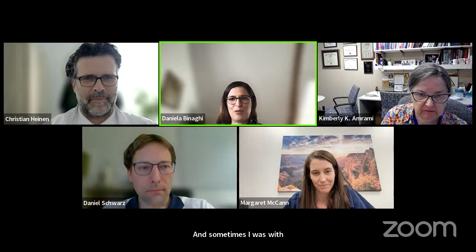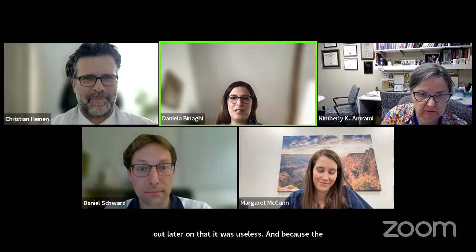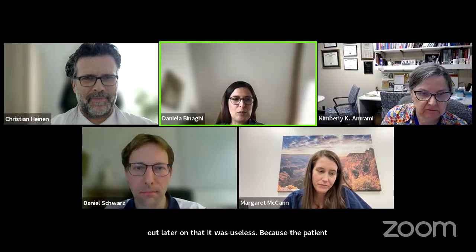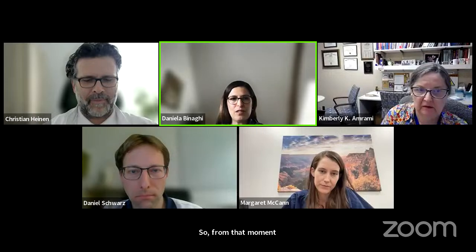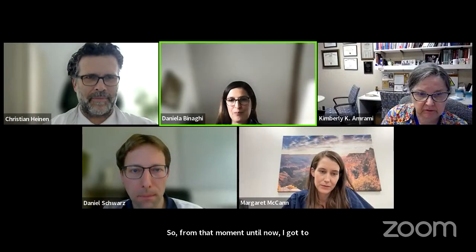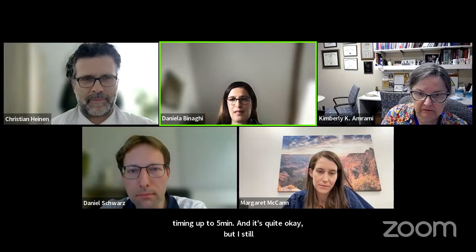Sometimes I was with the patient for 20 minutes to find out later on that it was useless because the patient moved, for example. So from that moment until now, I got to reduce the timing to 5 minutes. And it's quite okay, but I still have problems if the patient had a trauma and had some metal artifacts.